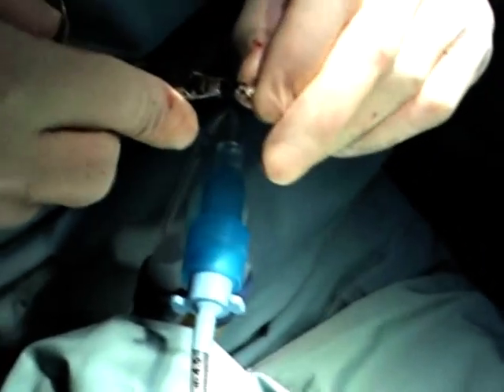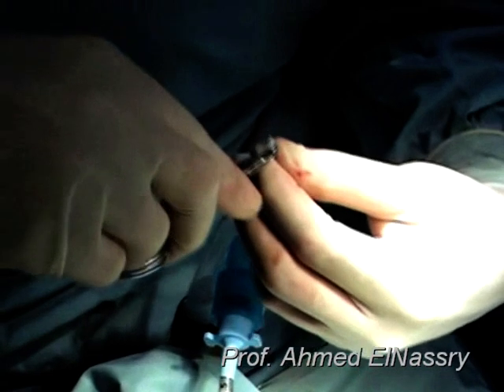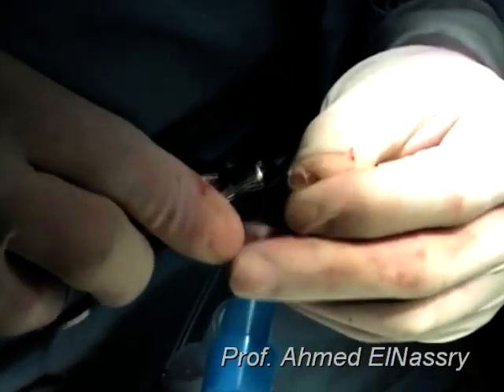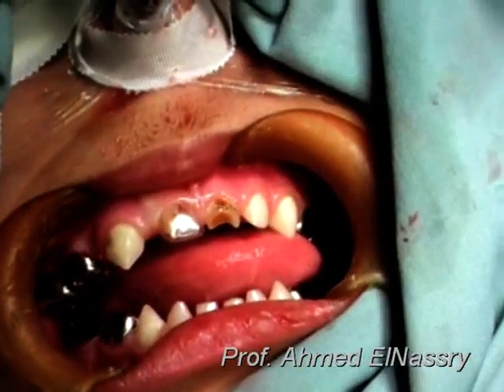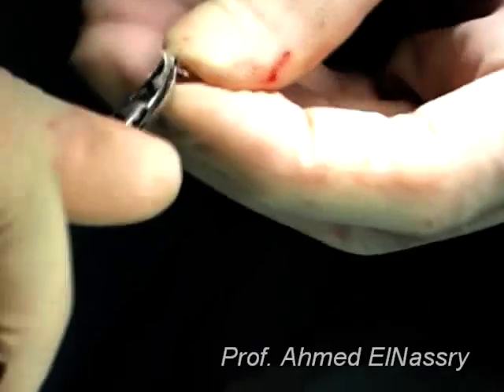The first step in performing the composite crown celluloid technique is to contour and adjust the celluloid crown to the correct size and try the celluloid crown. We did this in the tooth 51.